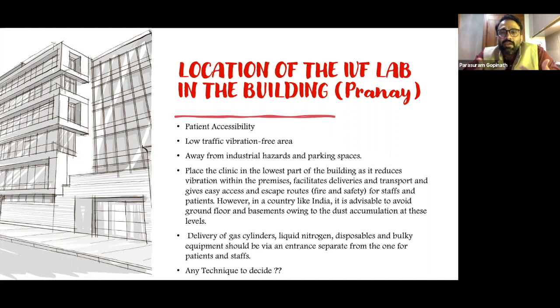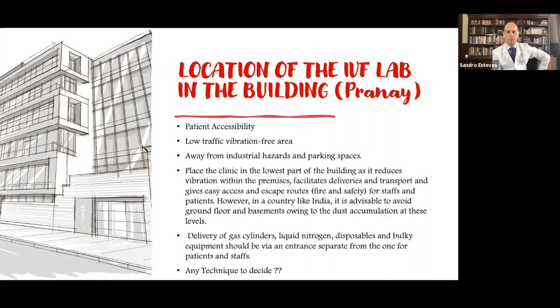If any of the other experts can comment on this, is there any other way that we can decide we should not do it here? Should we decide against doing it? Because the minute we changed the location of the lab into a different building in a different space, the results started coming up. So there was some contribution from that particular area to the IVF environment inside the lab. Is there something else somebody can add? Sandro, Giles? Yeah, I can continue, because I also contribute to this part.